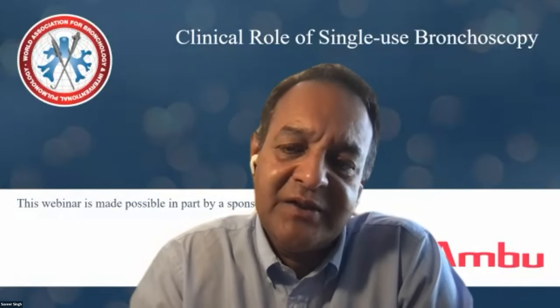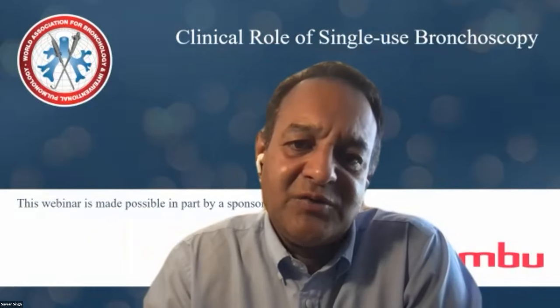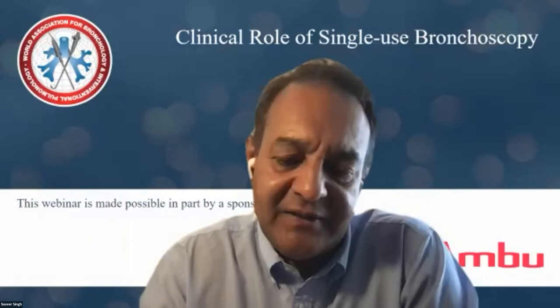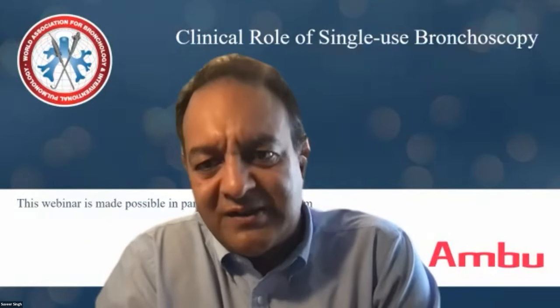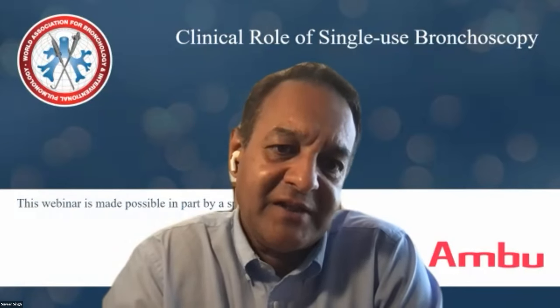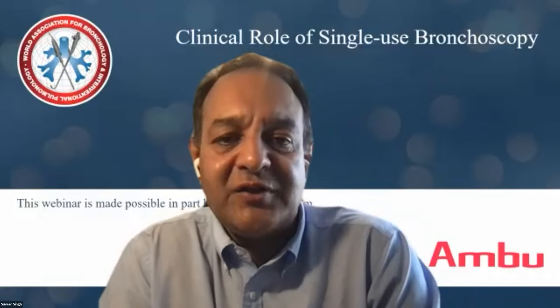From my own experience, bench testing them, the scopes are very equivalent to some of the reusable scopes that we use, certainly for standard procedures: simple diagnostics, infection, lobar collapse, etc. There was a question about whether the Ambu scope is any good for stenting procedures. I'll ask for your comments, guys, but I would say that hasn't been tested yet. I've certainly not tried putting a stent in using an Ambu scope or a Boston or any other single-use scope. I haven't yet either. Maybe with the next generation Ambu 5 scope that comes out, when we can get our hands on it, we can try, but haven't actually used it in that situation yet.